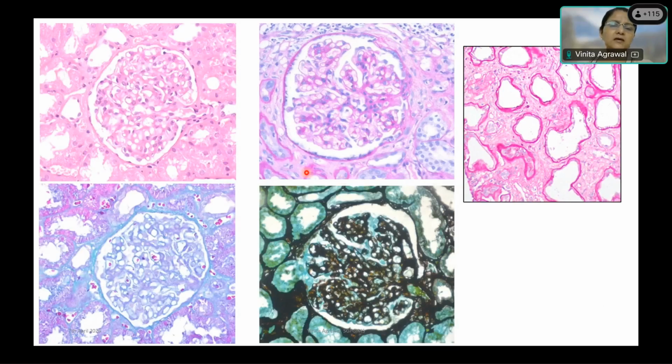You see this? What is happening to the tubules? That is why I showed you tubules in my previous slide. So you need to make out what this is. Hyalinization? Atrophy? When do you say hyalinization? When it is silver negative, when you find some material deposited.